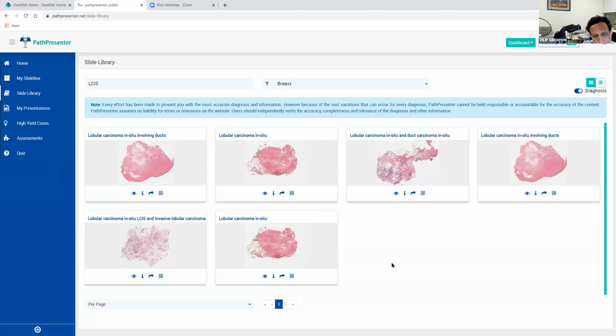Now, similarly, florid LCIS is also more likely to be associated with subtle invasion. So on core biopsies, we have to be mindful of that. And certainly from that picture you saw of the invasive lobular carcinoma with those big cells, the chances are that from the word go, there was an unusual type of LCIS in the setting of which that invasive lobular carcinoma happened.